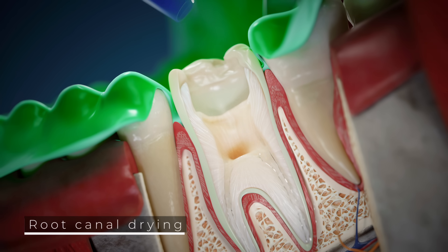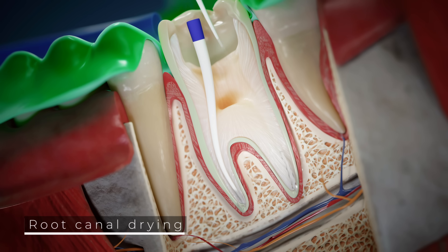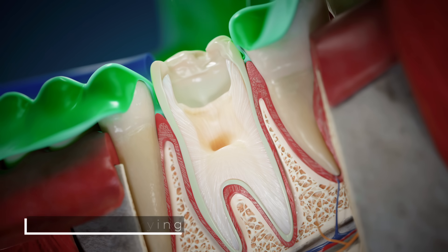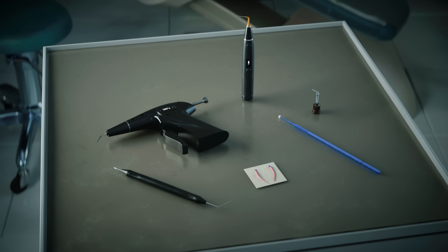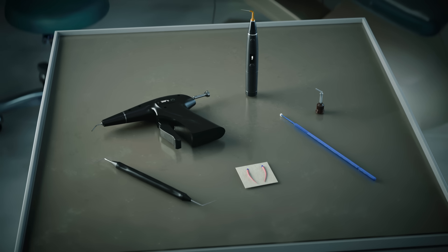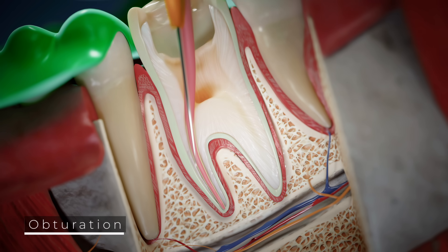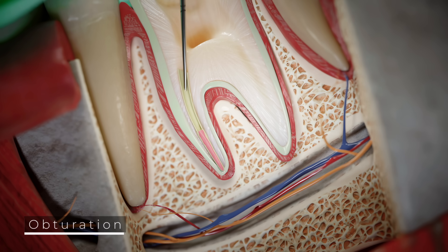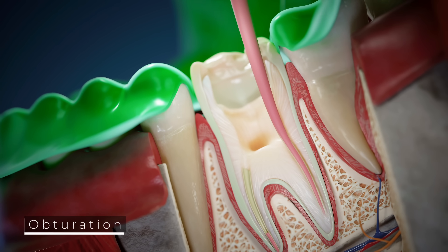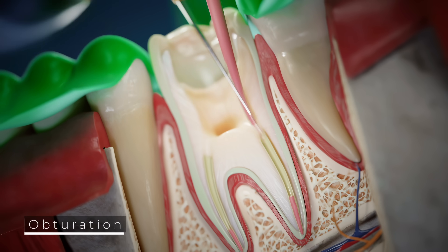Once the canals are cleaned, they are dried using paper points or a specialized drying solution. The root canals are filled with heated gutta percha and sealer, while gutta percha portions are compacted using cold pluggers.